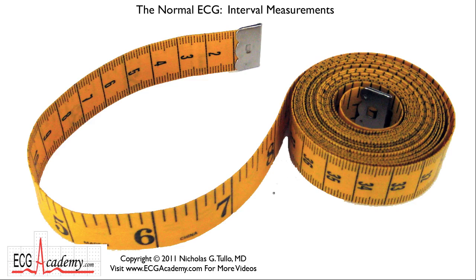Hi, this is Dr. Nick with the last chapter in this section on the normal ECG. We're going to talk about measuring intervals, because this is one of the first things that we do when we're trying to interpret an ECG.